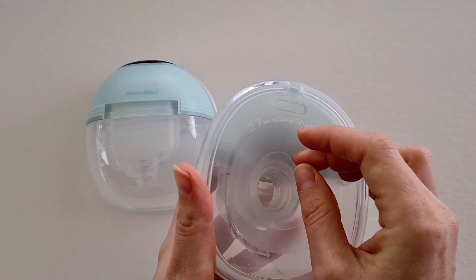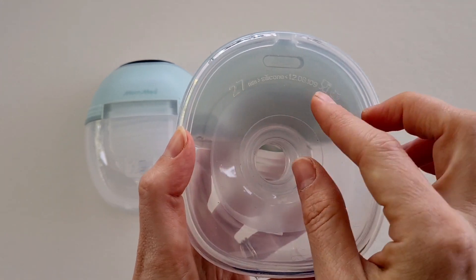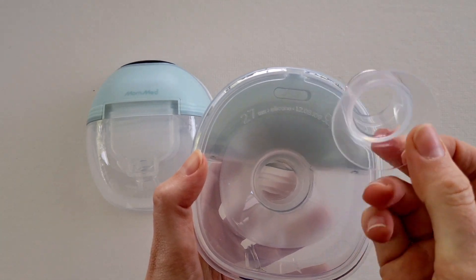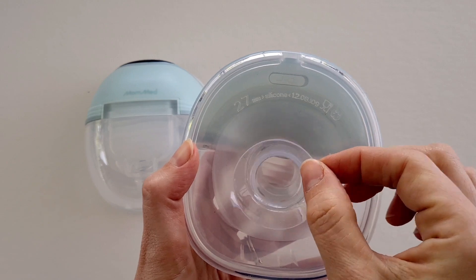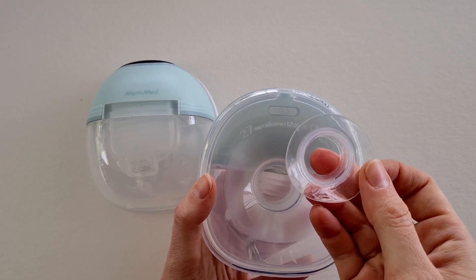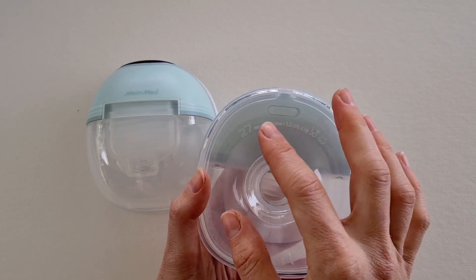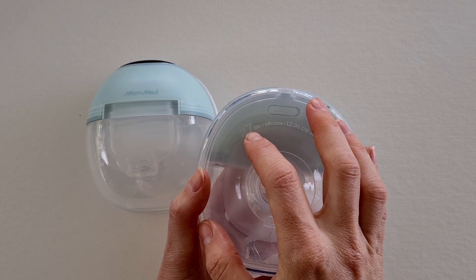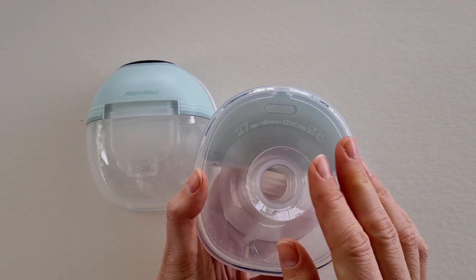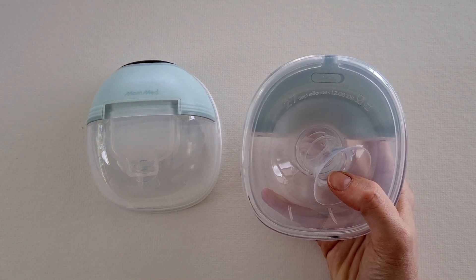Finally, this could be a perk or something you may not like: the standard flange size is 27 millimeters. It does come with additional flange inserts — there's a 24 millimeter that you can simply slide in. If you're wanting a smaller size such as 17 or 19 millimeters, these are available for an additional purchase and you can stack them to get the right size. Alternatively, you can purchase a 24 millimeter as the standard breast shield. This is just a consideration if you are after a smaller nipple size.